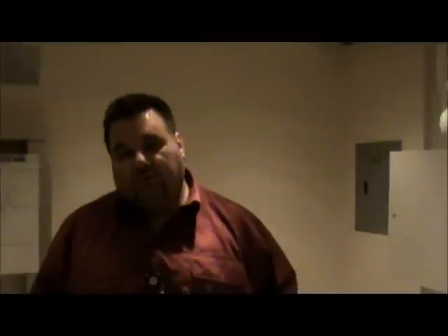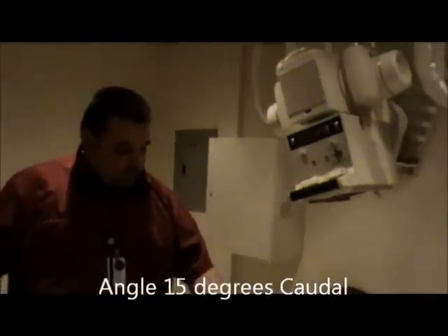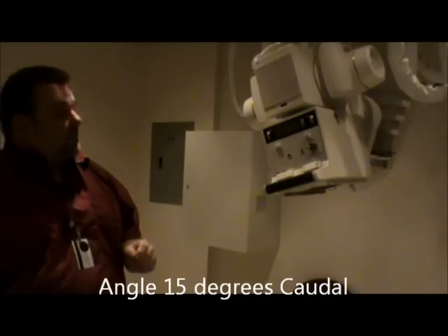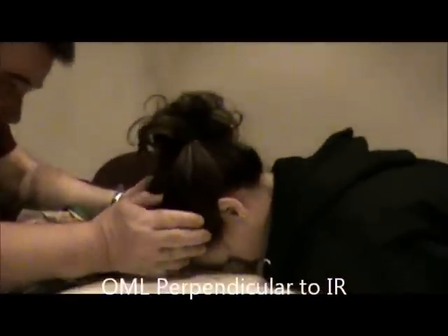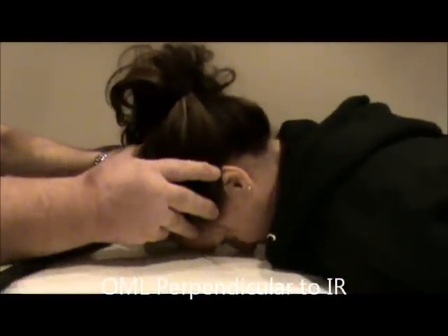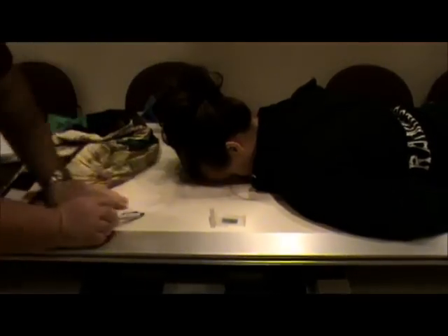The first thing I'm going to demonstrate is our Caldwell view. Our tube angle is going to be 15 degrees. We're going to center to the film and center lock. We're going to have the patient position their head just like you would for a PA skull. The OML will be perpendicular, so I'm going to have you put your forehead on the table. I'm going to make sure the head is straight, and the OML should be perpendicular to the IR — and it is.